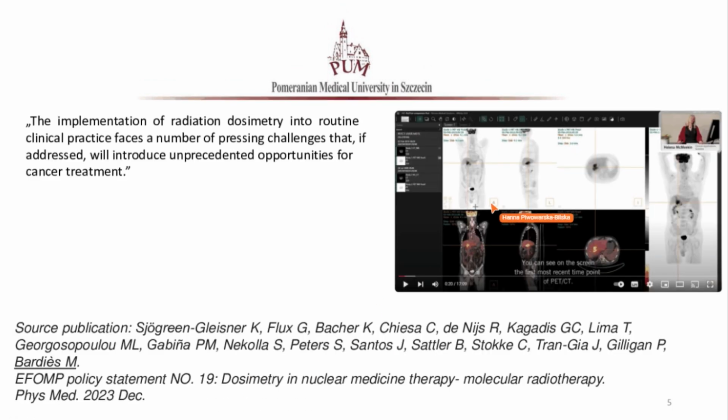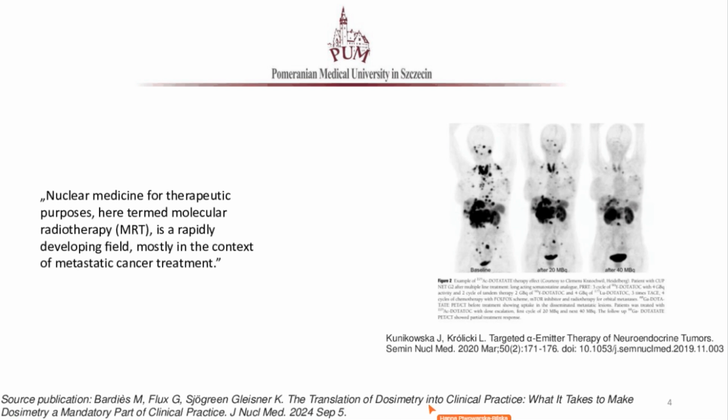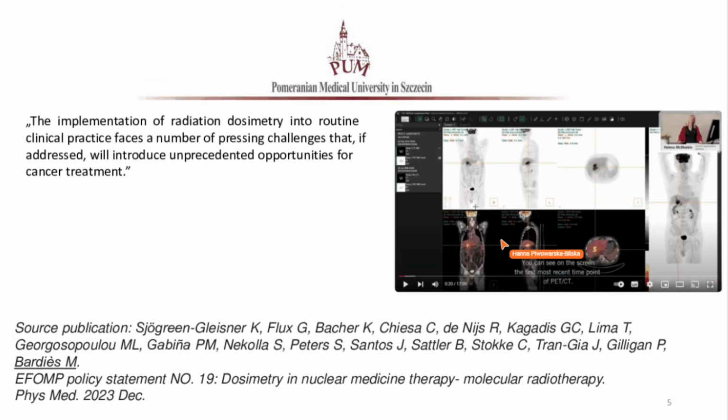Here you can see a picture that shows a series of PET images after application of an alpha emitter. The therapy and monitoring was performed in Germany, in Heidelberg University Hospital.